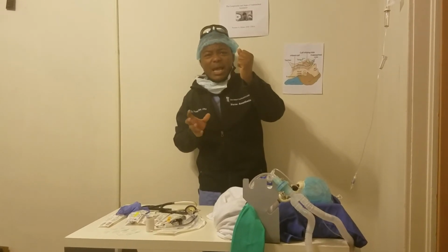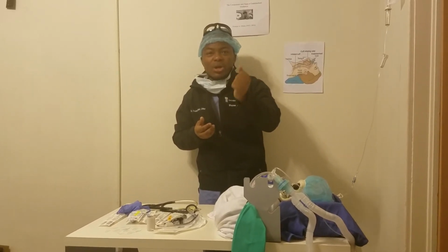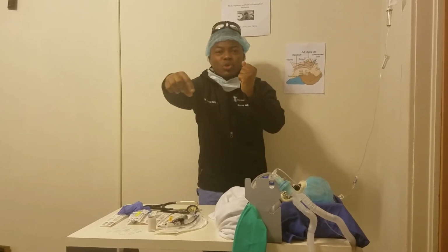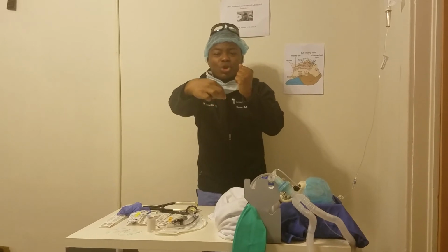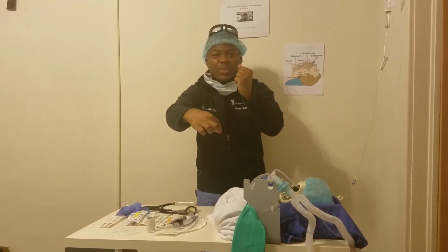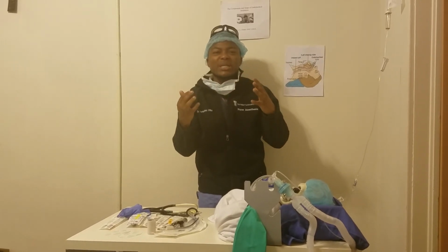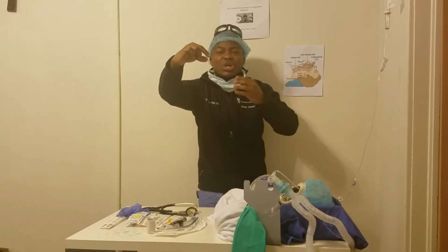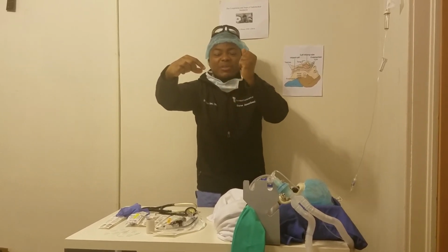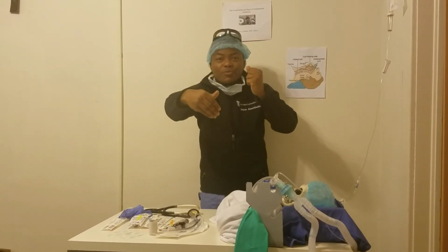All those steps and changes should help you see the glottic opening. If after doing those changes you still do not see the glottic opening, you may be able to put your finger outside, 2 fingers, or if you have someone assisting you, to help drop the glottic opening by depressing at C6 here. It's possible that the patient has what is called an anterior airway, and after confirming positioning, sweeping better, lifting further, you may be able to depress the glottic opening, which will bring it into view.